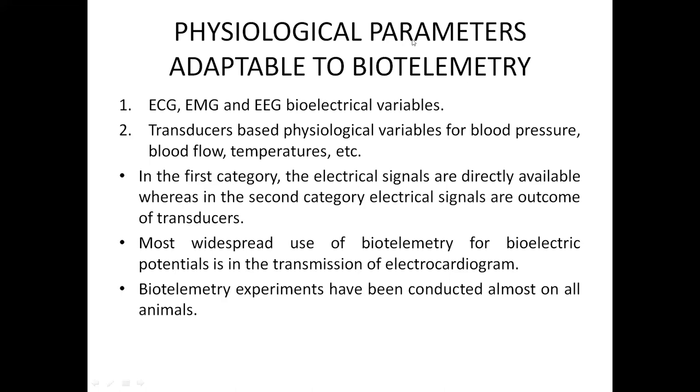With respect to these bioelectrical variables, we have to place the transducers. Everybody knows the basic principle of transducers in biomedical engineering. So in this transducer, based upon this transducer of physiological variables for blood pressure, blood flow, temperature, we have to measure all these physiological variables. We have to know particular transducer operations.